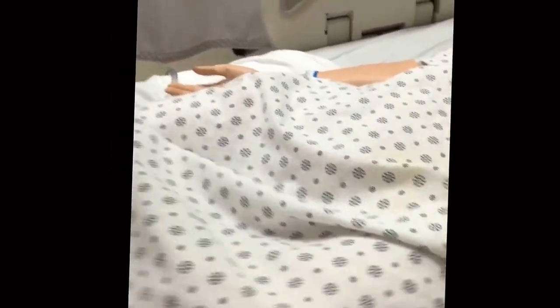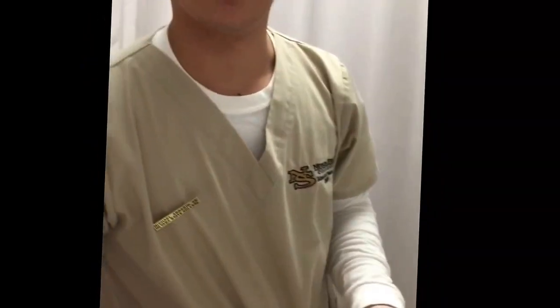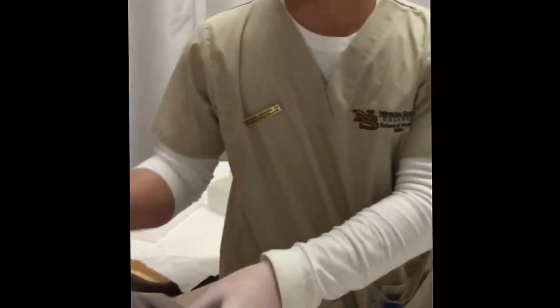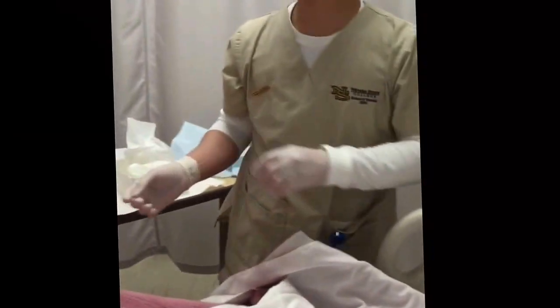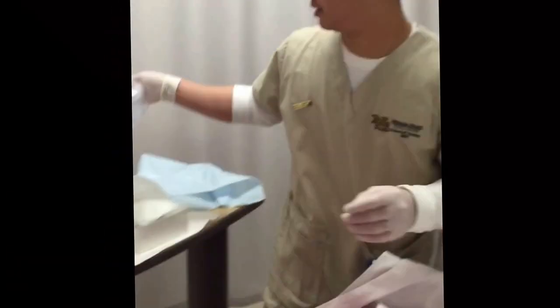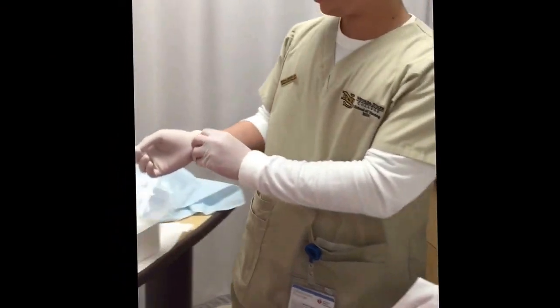Just put this back here, and you monitor the urine throughout your shift. Make sure you check it, make sure it's not too full before you dispose it. Okay. All right. Thank you, and put the blanket back there. Thank you so much, Miss Susan. You did really good. And please give me a call when you need anything. Okay. Thank you. Yes.